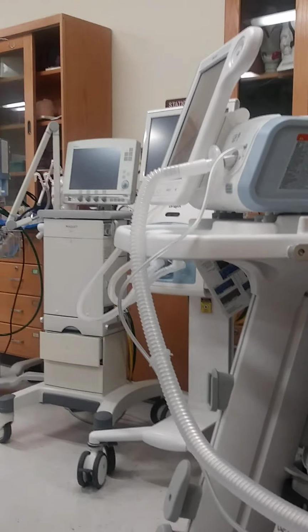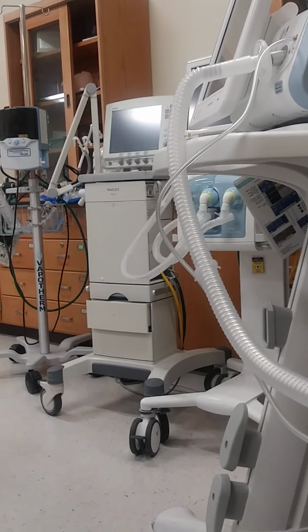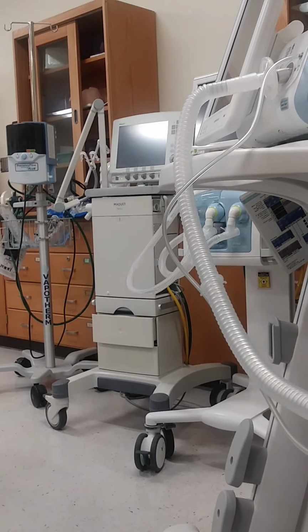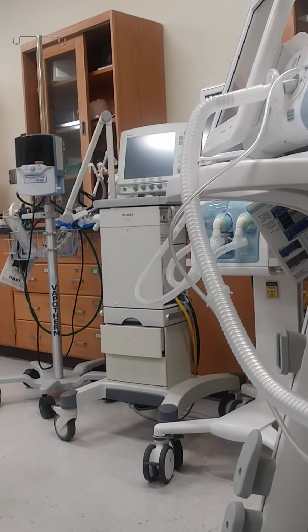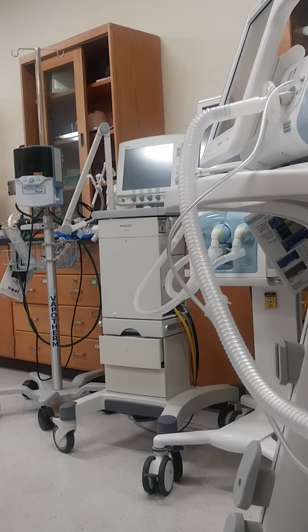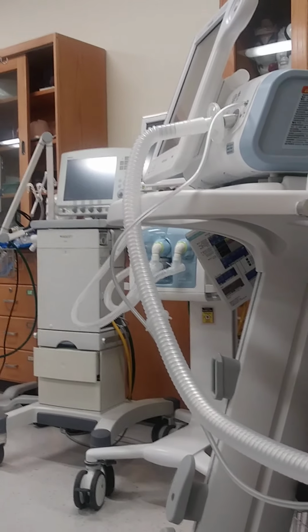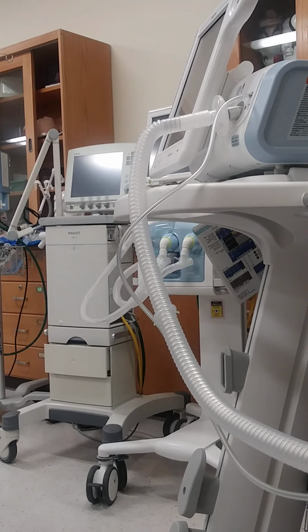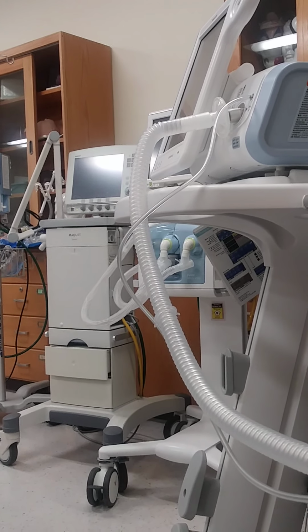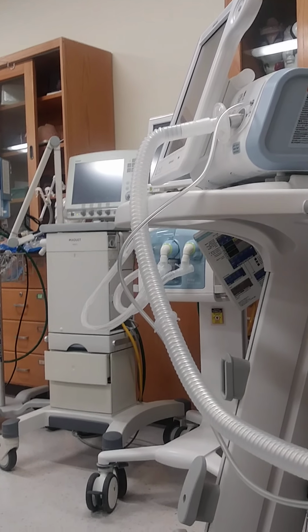So mechanical ventilation is invasive? Is invasive, yes. Mechanical ventilation, a ventilator is invasive because I actually have to stick a tube down their throat. And this is non-invasive because all I do is I place a mask, okay? And this is what we call non-invasive. But it works really well because we help deliver a volume in their lungs. We can help deliver pressures, and we can help give oxygen levels, and then we have other little things that we do on here to kind of fine tune.